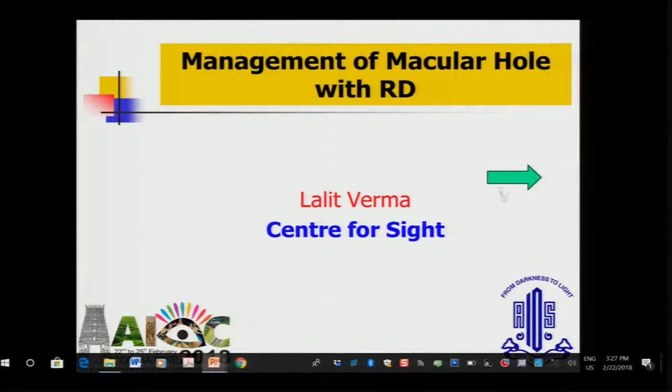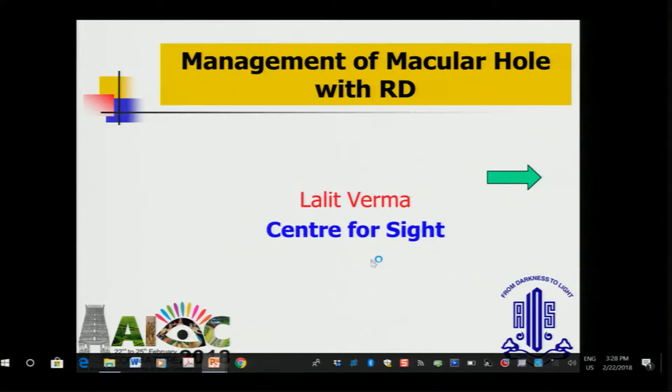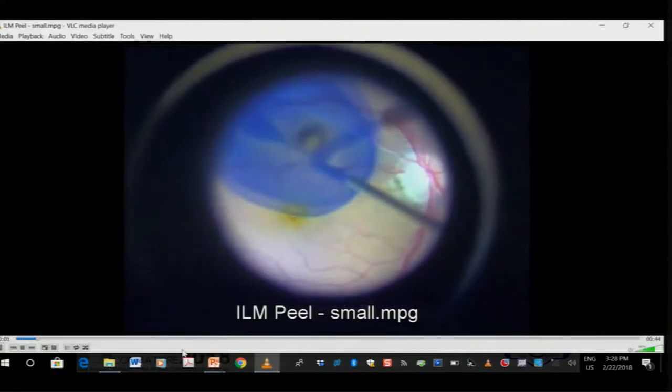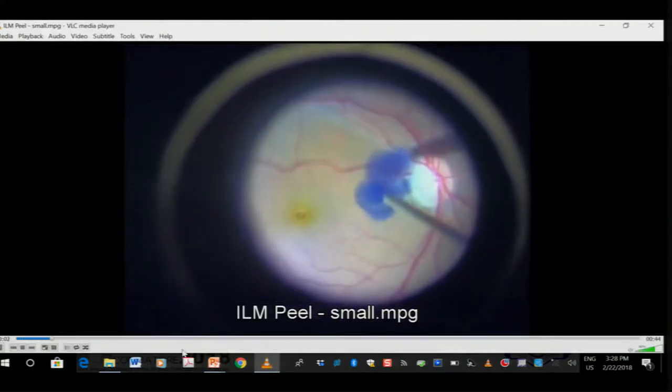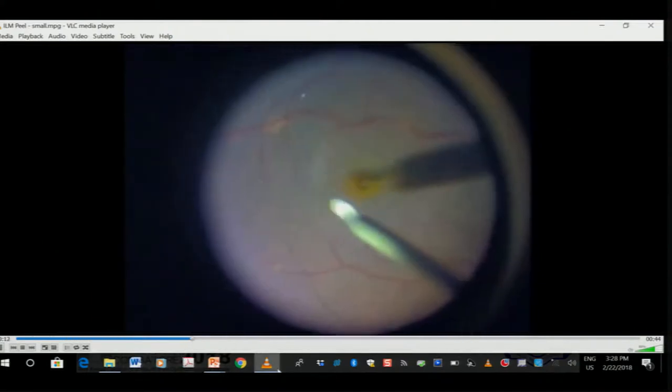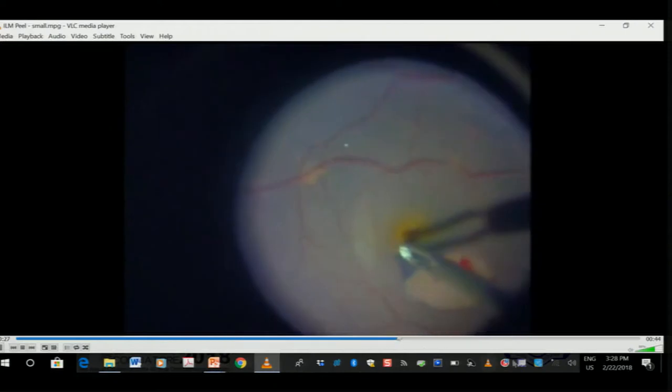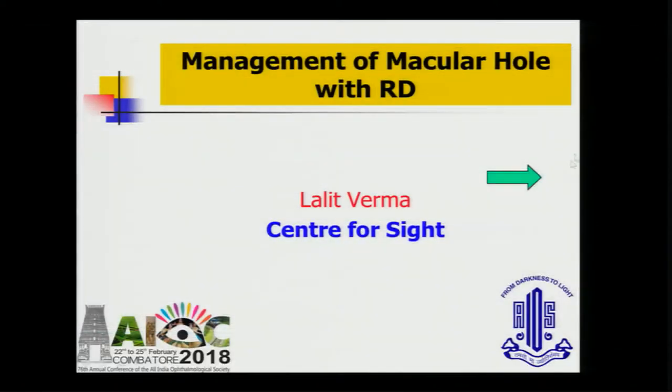But once you have a combined situation, that becomes slightly tricky, still manageable. This is the usual macular hole surgery which all of us do. Stain nicely like Atul had shown in very nice videos, then get an edge of ILM, peel and put SF6 or some air also.